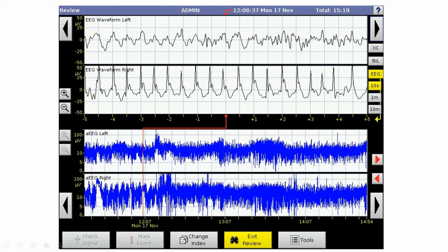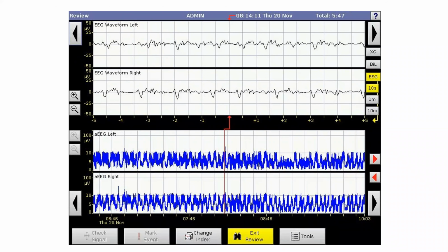The intermittent uprisings here are the things that really clue us into there being an issue with the brain, not necessarily with the background activity. The background looks pretty good, but there are definitely these uprisings which give us a clue towards the brain dysfunction. And then of course, we've all seen pictures that unfortunately look like this, where we have just constant uprisings. These aren't even intermittent anymore. They are continuous uprisings, and this would be our status epilepticus, another sign of a very, very sick brain.